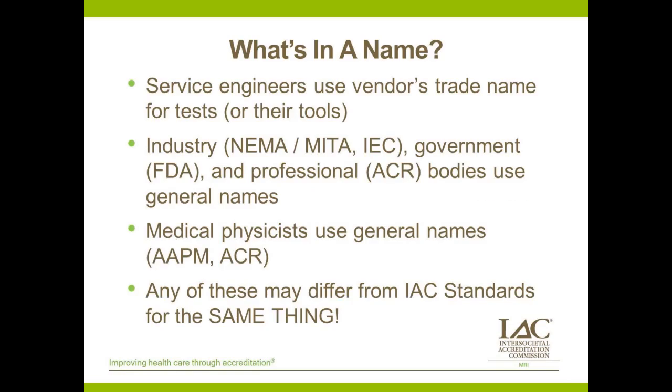Typically, the service engineers for a company will use their own trade name for a given test, or in many cases, they actually won't be talking about the name of the test itself. They'll be talking about the name of the tool that they use to do the test. So I've run into this quite a few times.